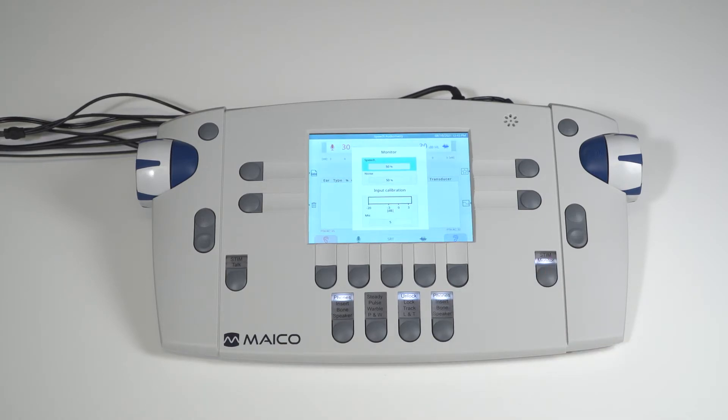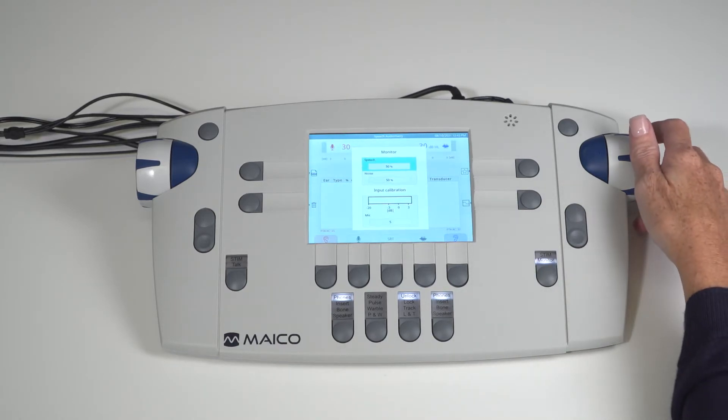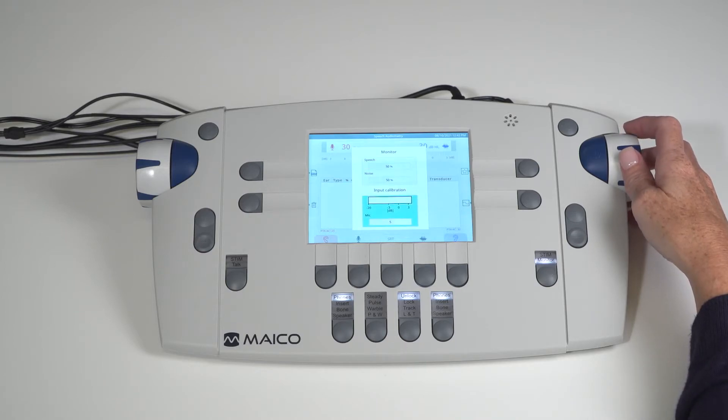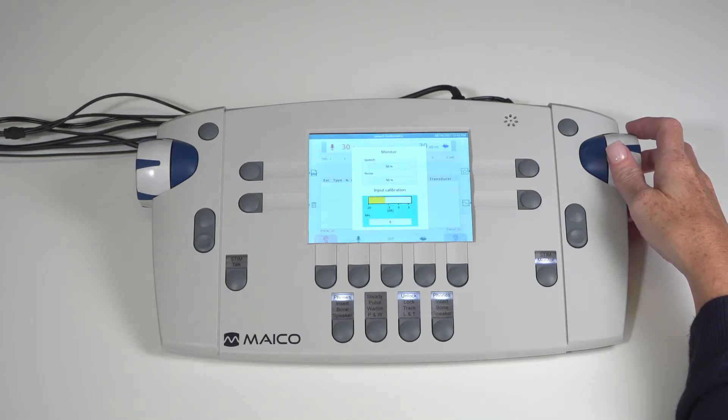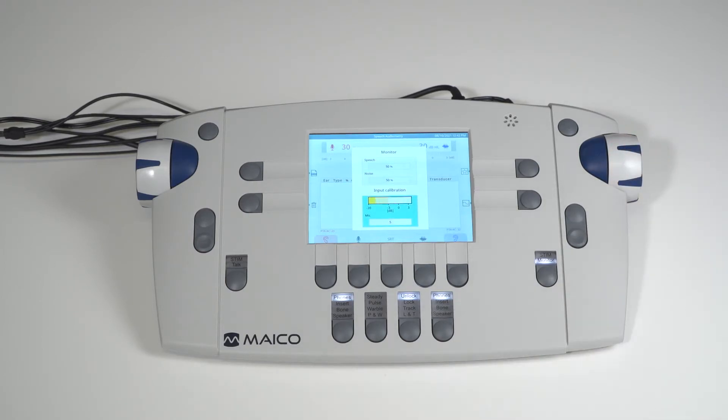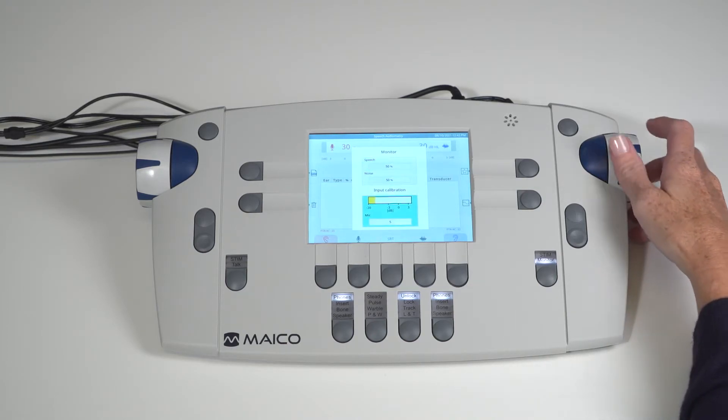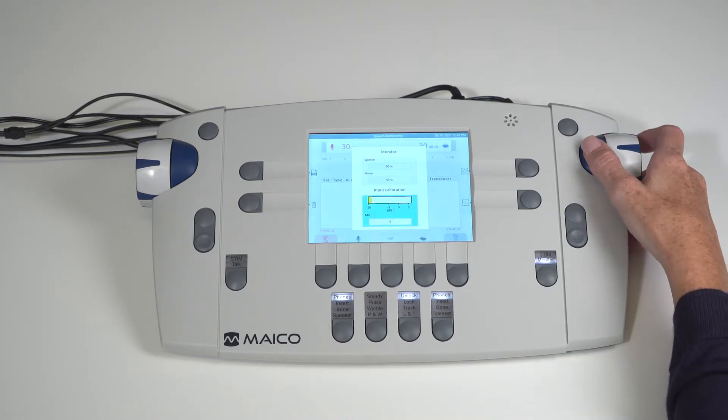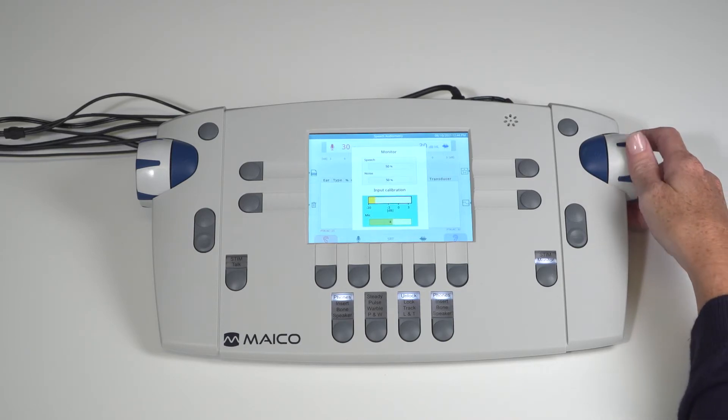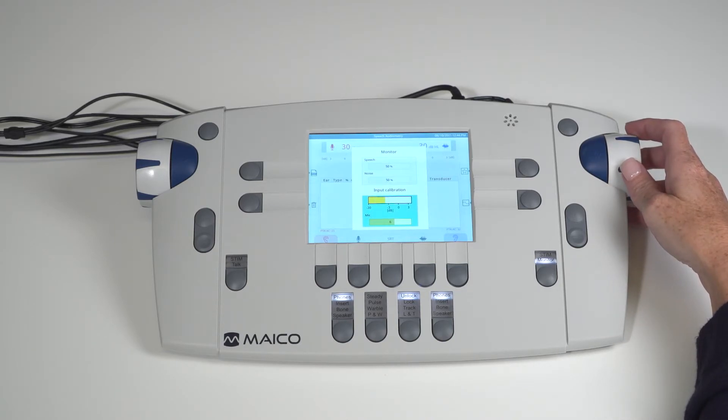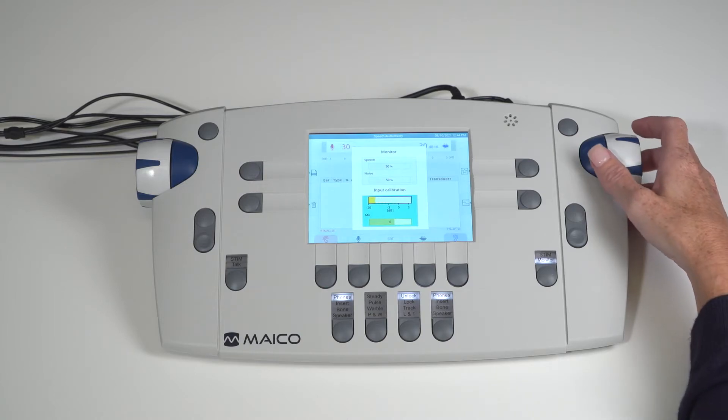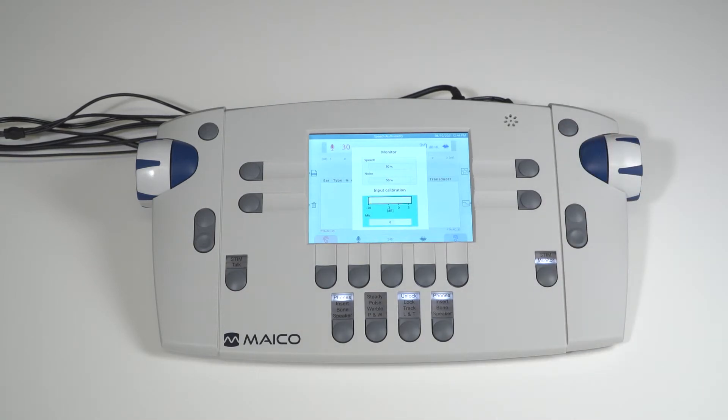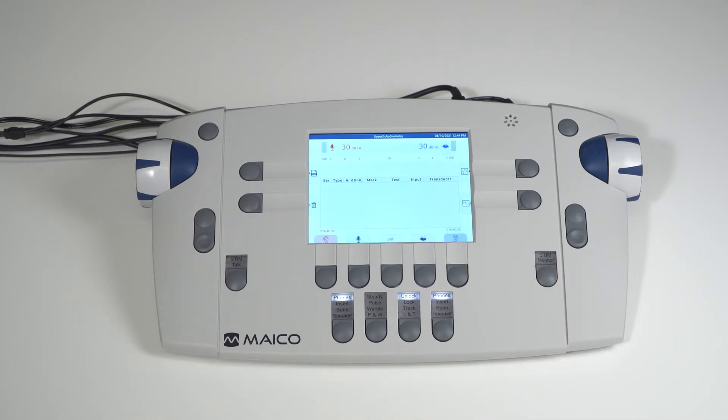Calibration of speech inputs is necessary for the microphone and auxiliary use. To calibrate speech inputs, select the monitor key while in the speech screen. Use the side dial to highlight input calibration. Adjust the side dials until the VU meter shows green and is not peaking into red. Select the present key to activate the selection. When the adjustment is completed, press the stim monitor key to save the settings and to return to the speech test screen.